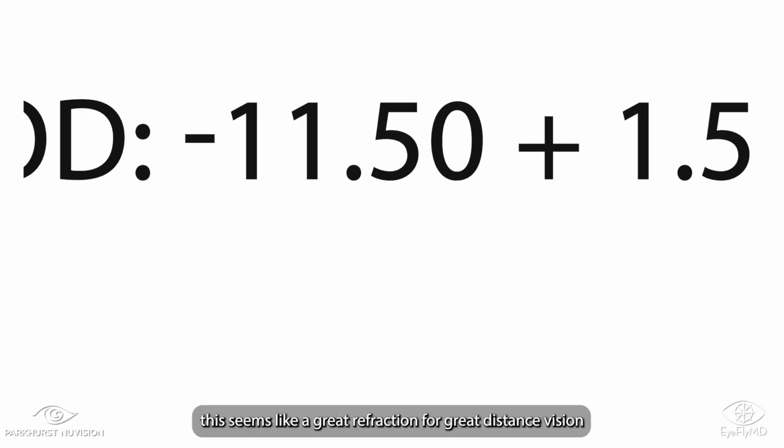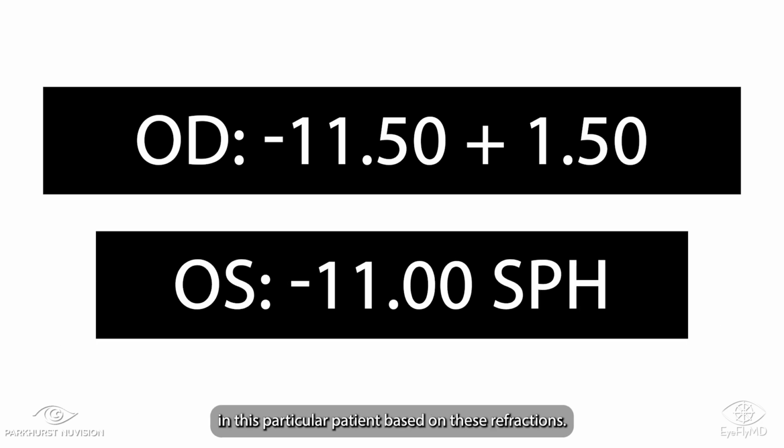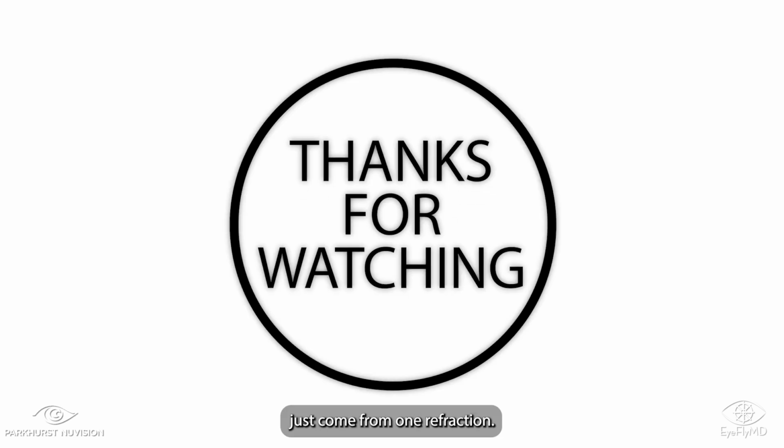So altogether, this seems like a great refraction for great distance vision in this particular patient based on these refractions. You can see how nuanced this is and how all the values didn't just come from one refraction.